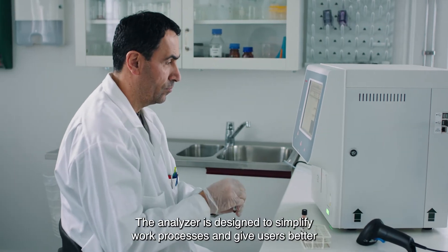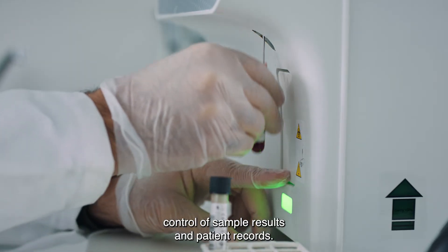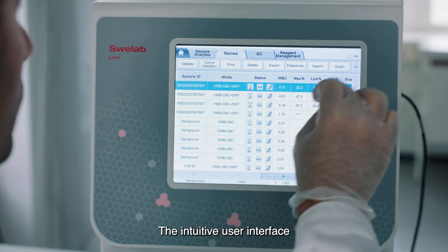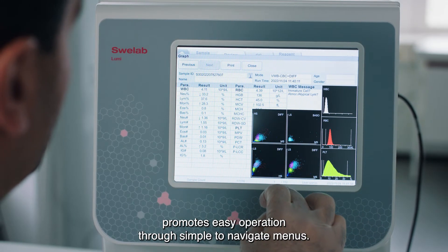The analyzer is designed to simplify work processes and give users better control of sample results and patient records. The intuitive user interface promotes easy operation through simple-to-navigate menus.